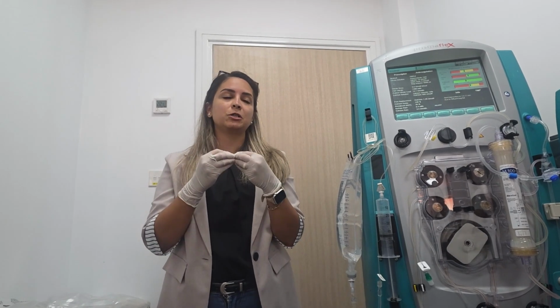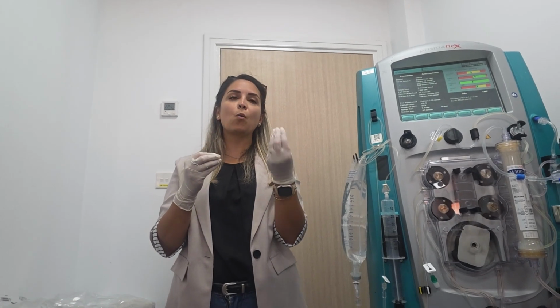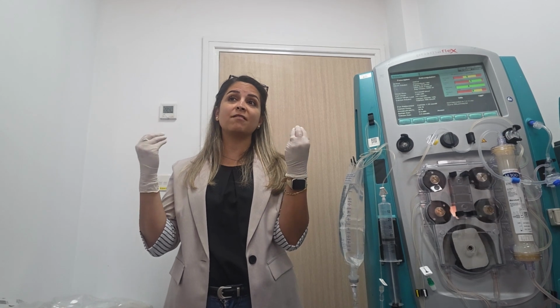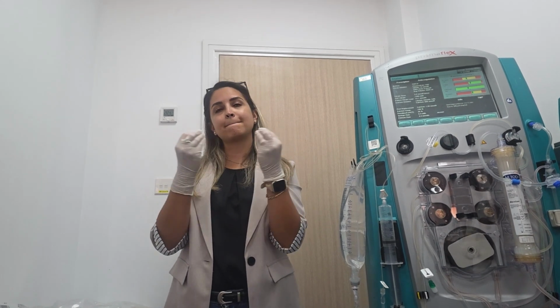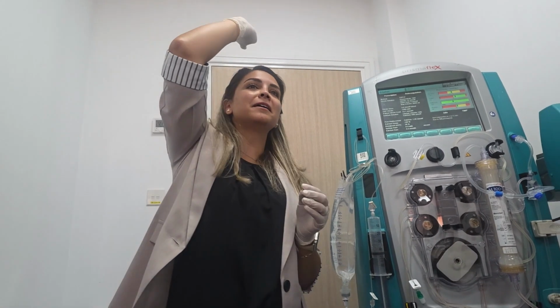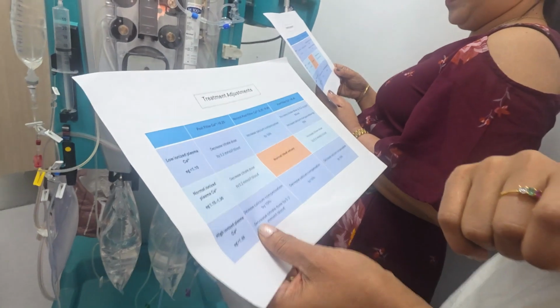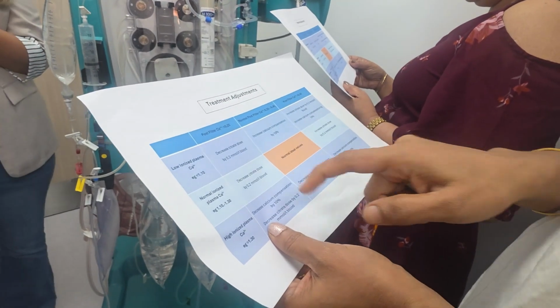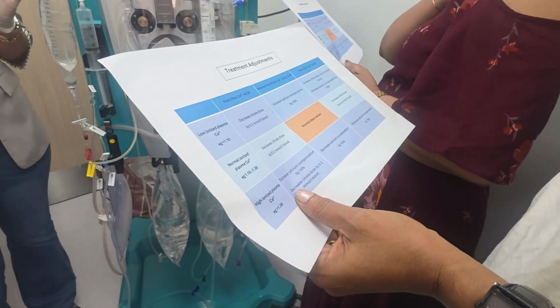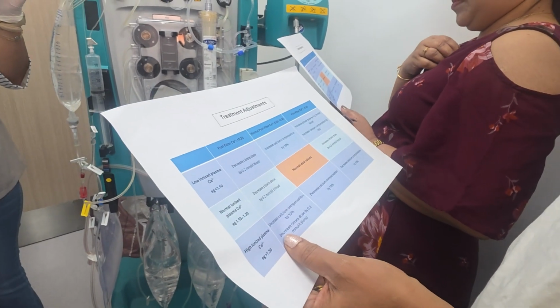Now you took the 2 samples from the ABG machine. From patient side, it was 1.1. Machine side, it was 0.35. Normal, both of them. So what will you do? Keep it the same. No change.